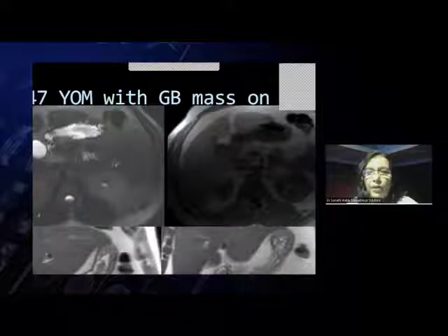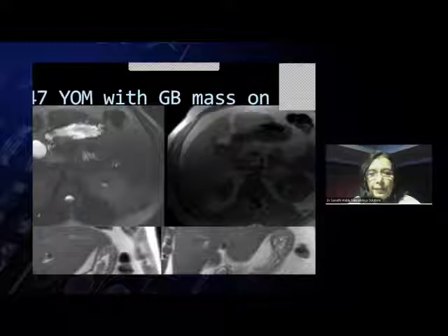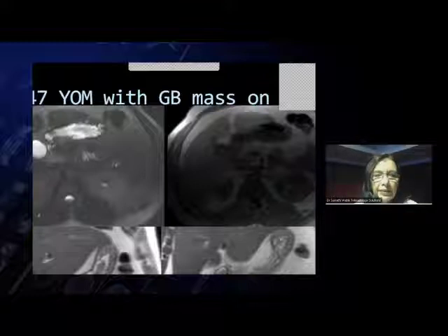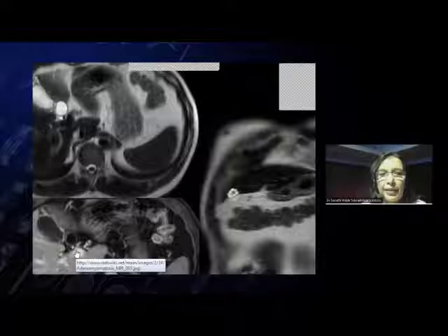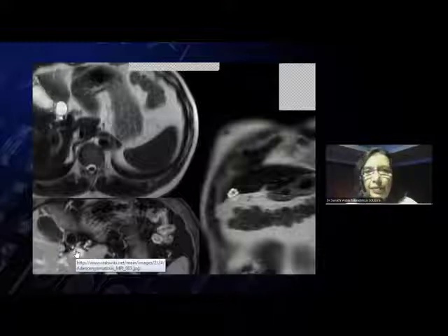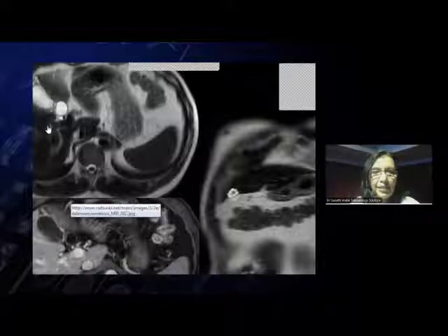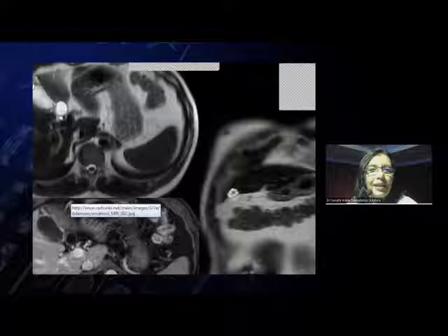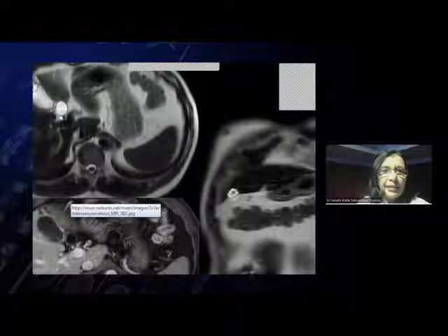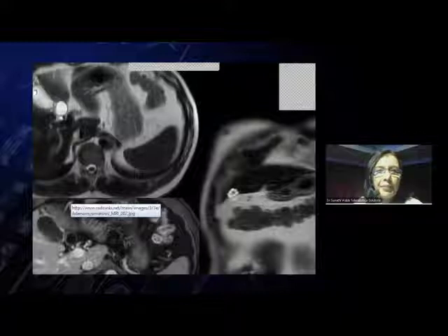Moving on to some selected T2-weighted axial and coronal images. This patient had a finding on ultrasound which prompted focal gallbladder wall thickening, which in turn prompted MRI imaging. You can see these nodular, semi-circular areas on the T2-weighted images which are fluid-filled because they are bright on T2.